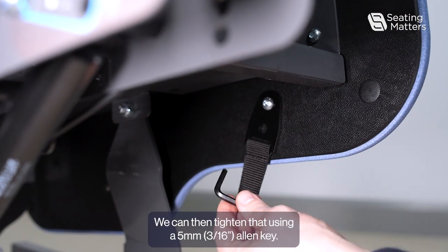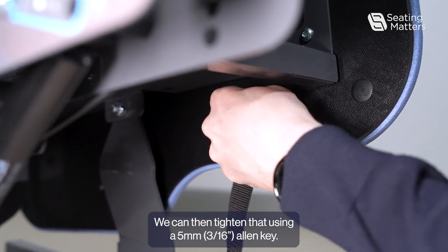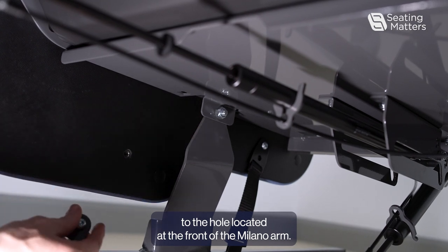We can then tighten that using a 5mm Allen key. Then fit the other attachment to the hole located at the front of the Milano arm.